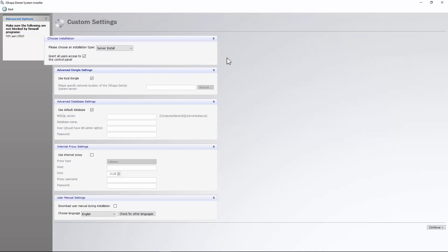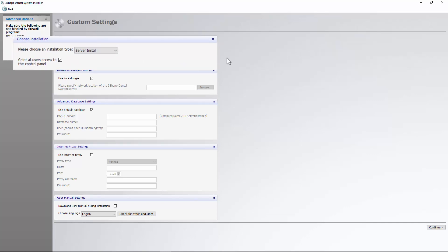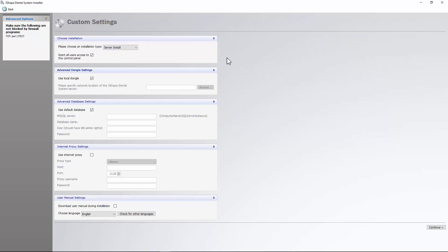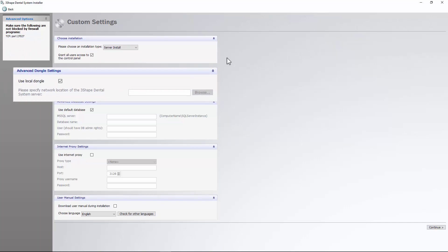We recommend giving all users access to the control panel. If the dongle is located on another server, leave this option unchecked and specify the network path for the server.